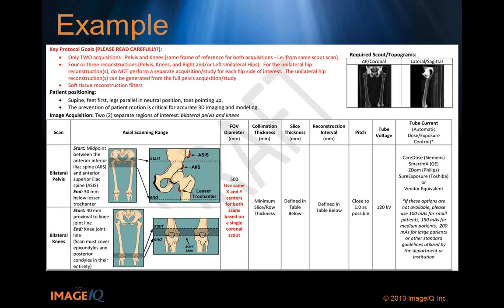And we actually go through a process of validating that ourselves with a phantom, but you might have to use other means to do that validation.